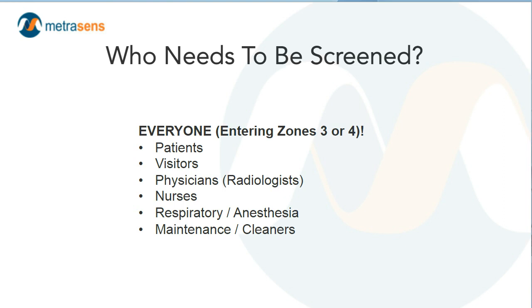So screening really needs to be universal. It needs to apply to every individual entering controlled access parts of the MR suite. Full stop, no exceptions.